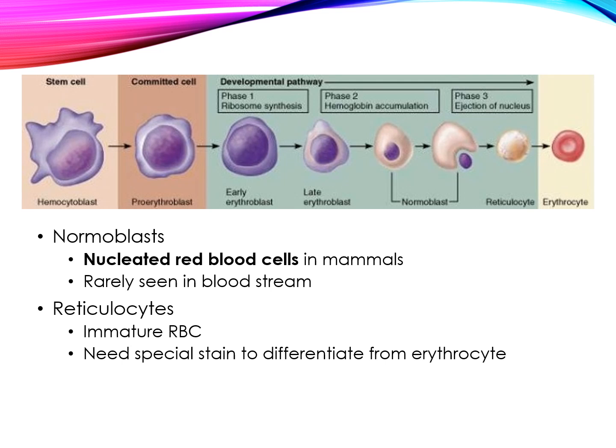Also, another interesting thing about nucleated red blood cells is that the hematology analyzers may count them as white blood cells because they have nuclei. If you see a significant amount, there is a mathematical equation which makes up for the amount of cells in the differential that may have been counted as white blood cells when really they were immature red blood cells.